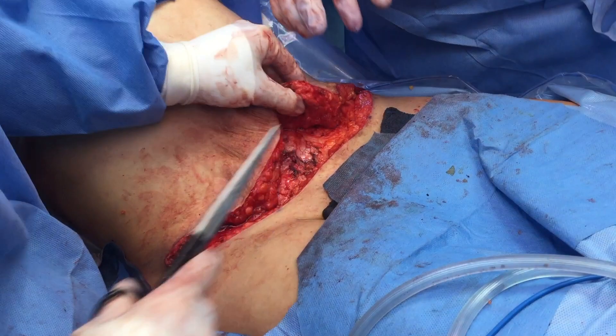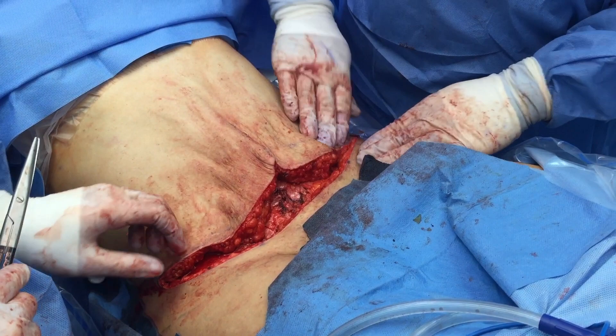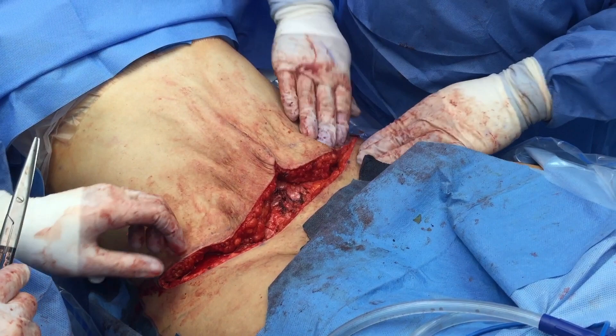What seemed like it was going to be a bit of a far reach is now coming together really easily and springs forward. I have one right here — it's taking a few extra minutes, but not much. I'm going to take one more stitch, advance it here, and it's going to take all this tension off the midline. We're going to be able to come together really nicely.